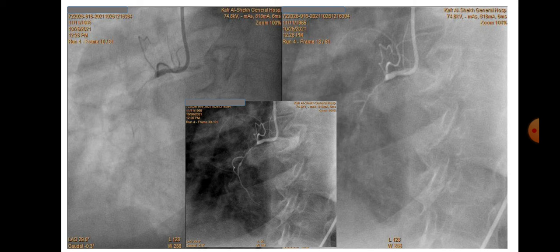As we see here from the traditional angiograph, the functional channel is not so clearly apparent. But when we invert the grayscale, I think it is so much clearer. This gave me the chance to precisely track this microchannel with a shallow bend of the tip of the guide wire, going directly and precisely with a steerable wire through this microchannel with a tapered tip wire.